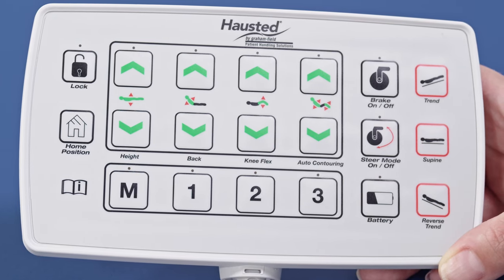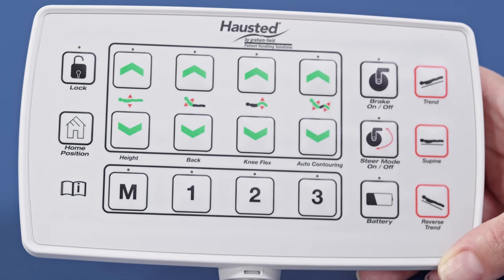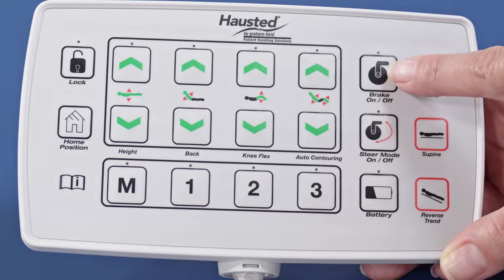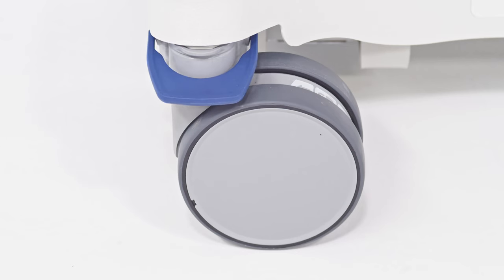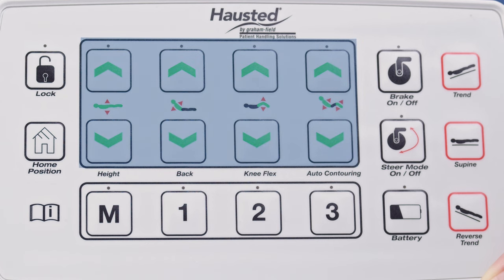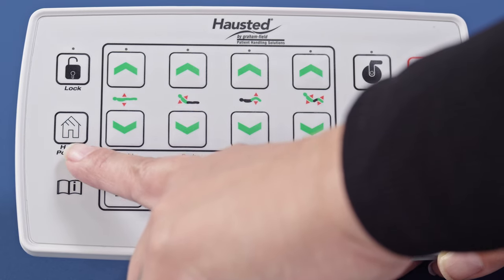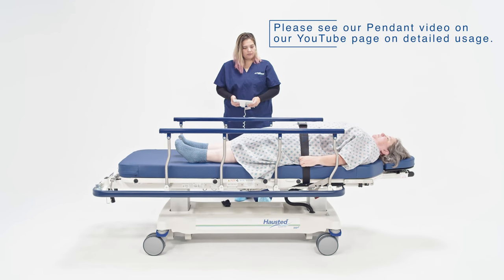The intuitive hand pendant puts all stretcher functions at your fingertips. Brake, steer, height, and positioning presets are located on the easy-to-understand pendant. A home preset allows for quicker entrance and exit from the stretcher.